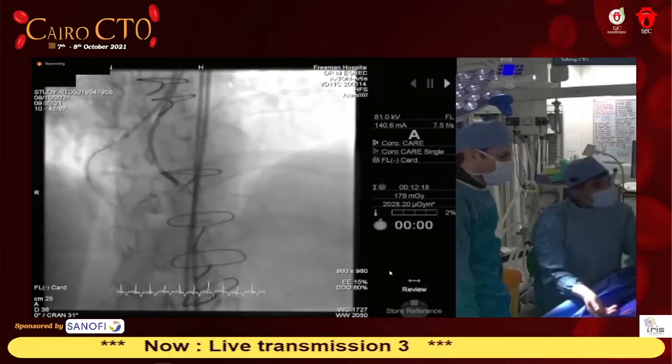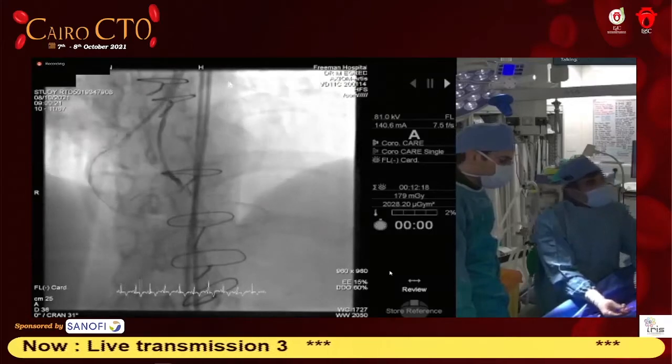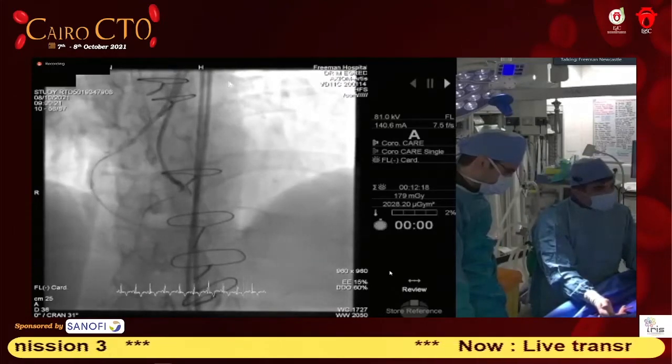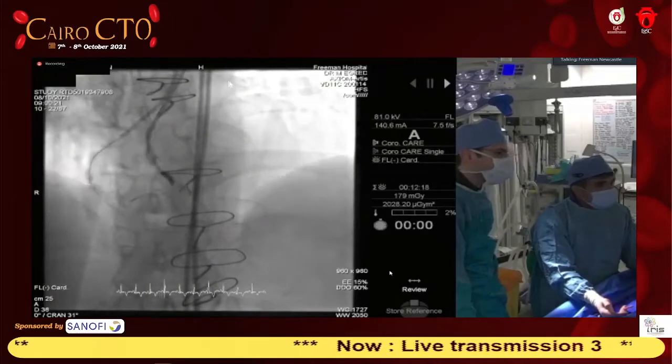Boston has innovated some new wires. Did you have experience with it? I mean... no, I haven't. They are supposed to be coming to us. COVID has slowed everything down, so we haven't. Yeah, they've got the Hornet and they've got some Fighter, and I've used them.